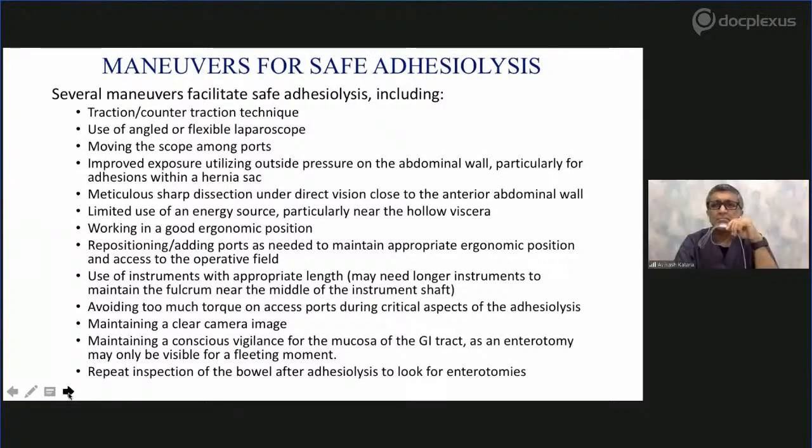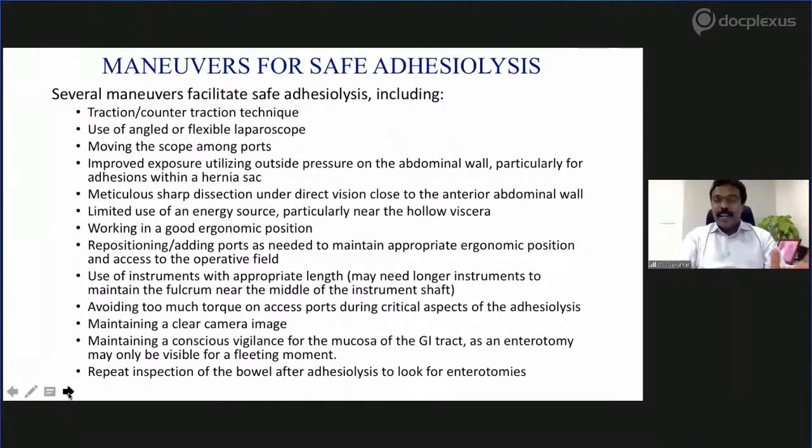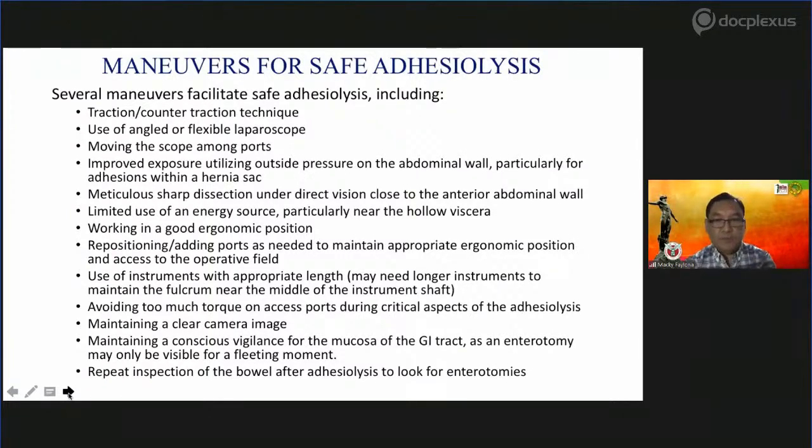Here, don't tell like Dr. Shiva, like I am an initial surgeon, I want to do a harmonic scalpel or a vessel sealing system here. Just use whatever the doctor told. Just use a scissor without any cauterization. That's all. And you have to make sure that you use the proper instruments in grasping your bowels, because you don't want to make a lot of serosal tears if you are too rough in handling of the bowels as well.